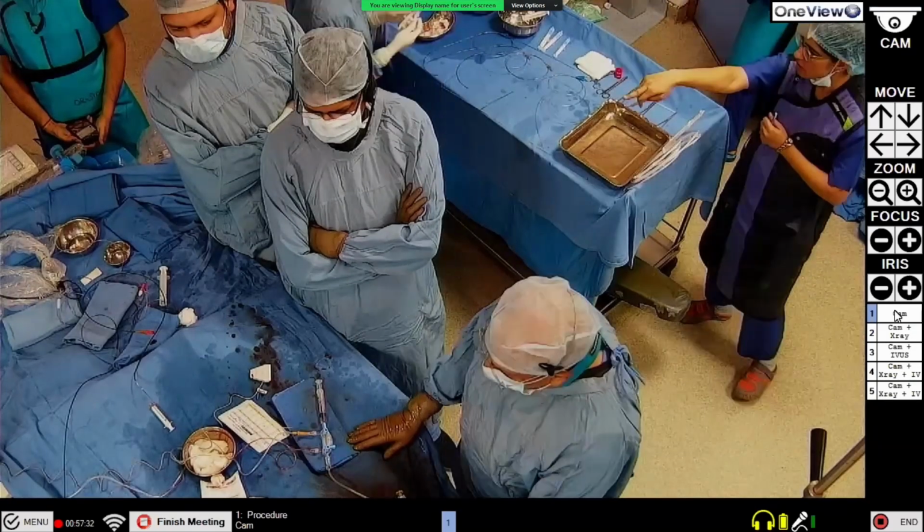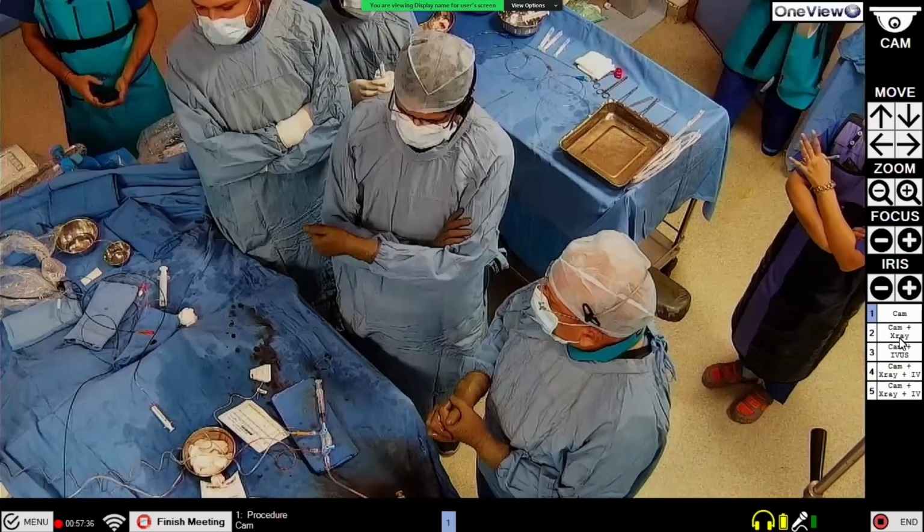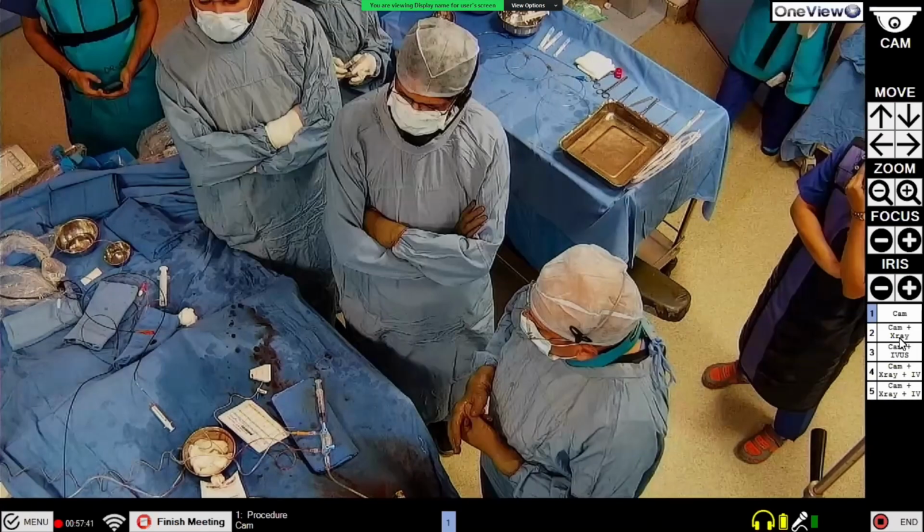This is the nice way to demonstrate new technologies, that using IVL, using IVUS, using imaging and physiology in the right way to give a good result to the patient.